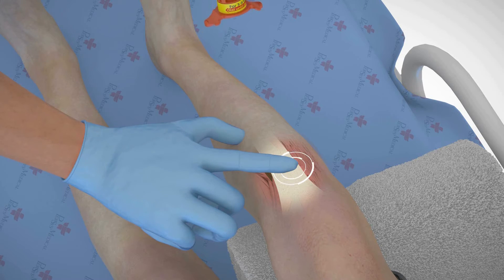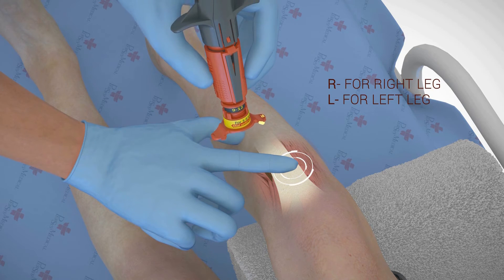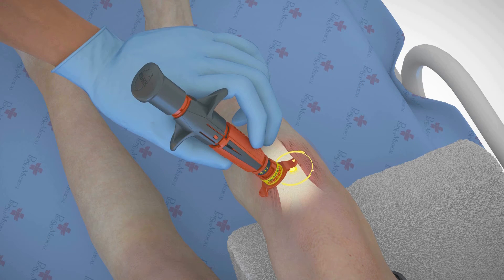While holding at the textured dots, place the designated location arrow on the prominent aspect of the tibial tuberosity. The location arrow should point towards the knee.